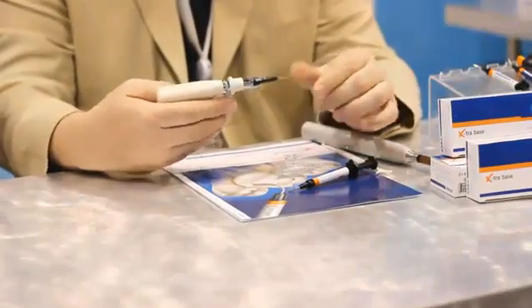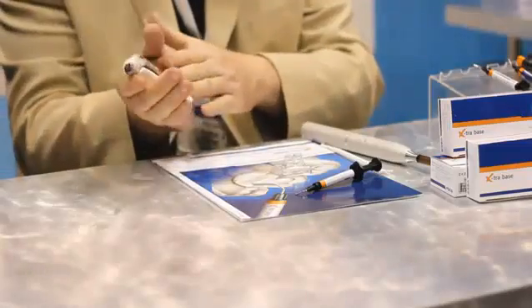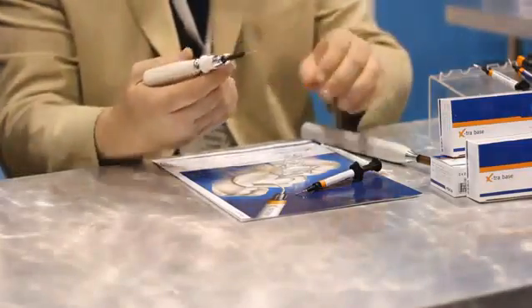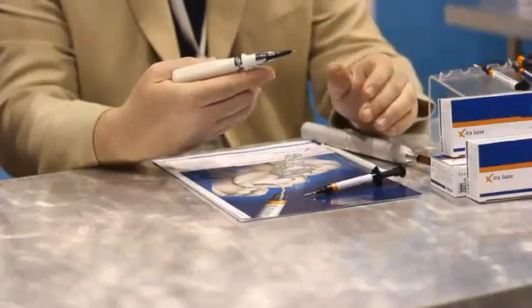Can you show us how it works? Absolutely. The material comes in both a syringe delivery and a compule delivery, and I really prefer the compule delivery. VOCO has a very nice ergonomic composite gun that feels very good in the hand and it's very easy to control the amount of material that comes out of the tip. I like the compules because you can bend the tips, and when working in the posterior areas where you're going to be doing a lot of these bulk fill cavities in premolar-molar regions, it really helps for access and control.